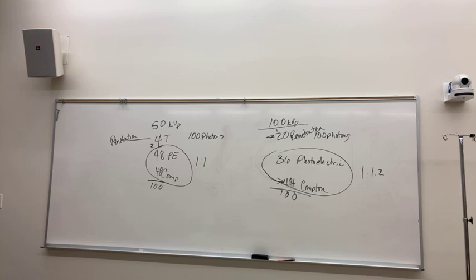I have a question. Shoot. So when you increase kVp, the patient dose increases, but earlier we talked about the photoelectric absorption, that increases their dose. So how does increasing kVp increase the patient dose if they're not being absorbed as much? Good question, good question. All right, so there too, we've got perspective, okay?